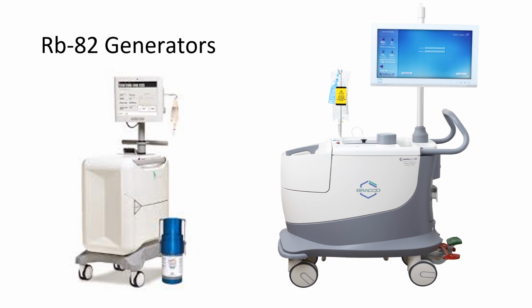So these are the two commercially available generators. On the left is the RubyFill generator that's produced by Jubilant, and on the right is the Cardiogen generator that is produced by Bracco. Both of them require that saline that are on there. Both of them have a computer touchscreen where you control the elution and the patient information. And then for both of them, this bulkier part of the cart is where the generator actually resides.